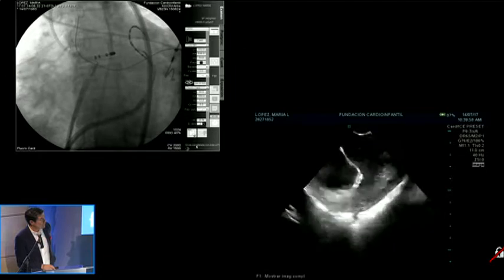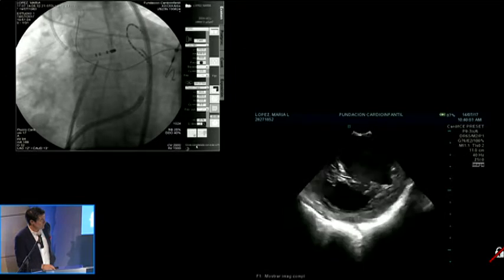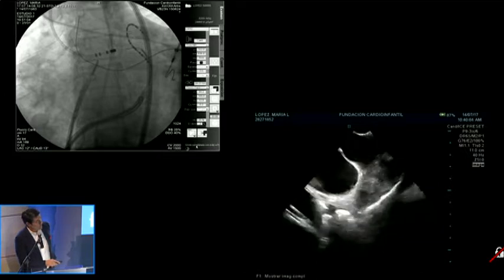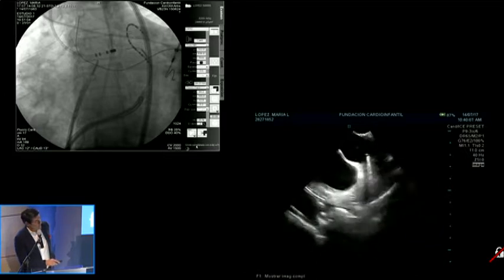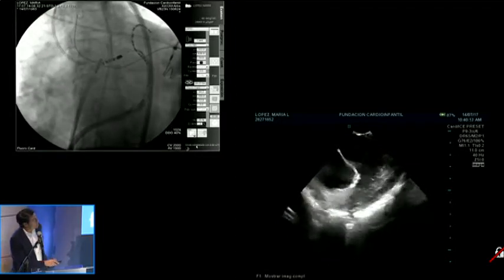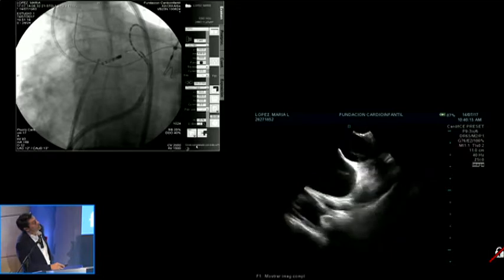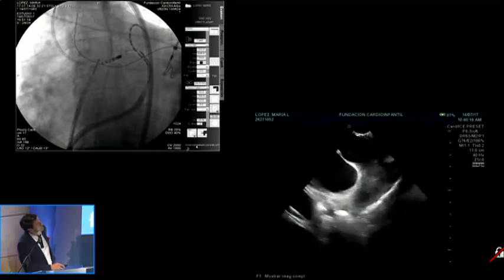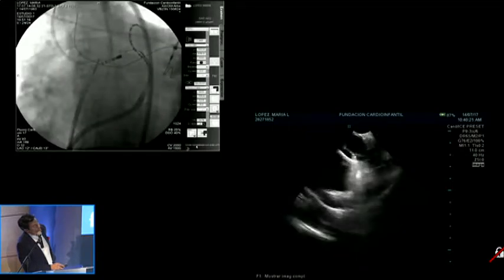Here on the ICE, this is the ventricle. This is the anterolateral papillary. We move clockwise. This would be the beginning of the outflow tract. The catheter is too basal, in front of the base of the left ventricle. This is the base of the left ventricle, as you can see in this area.